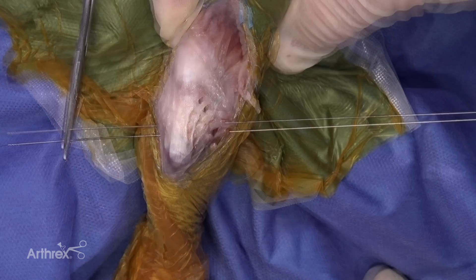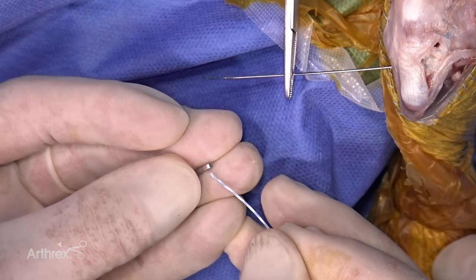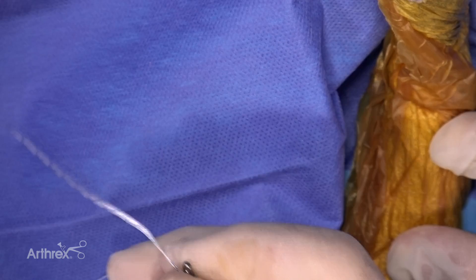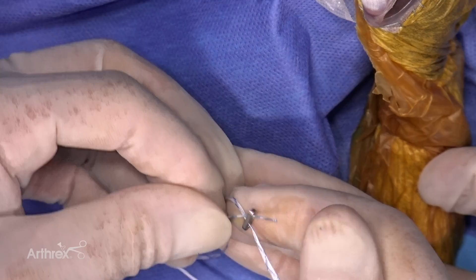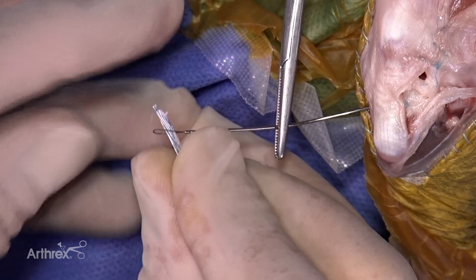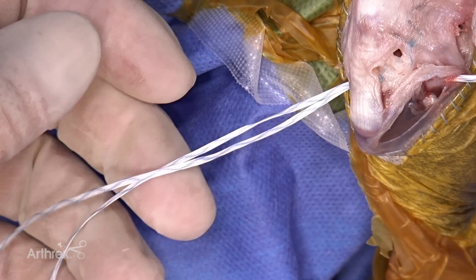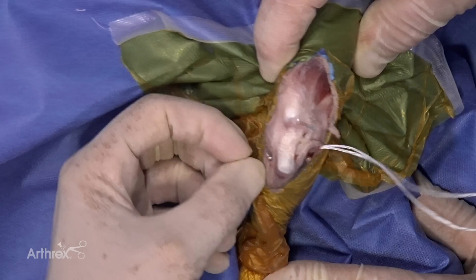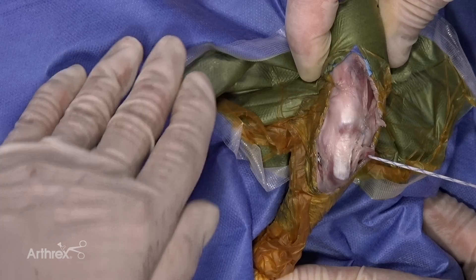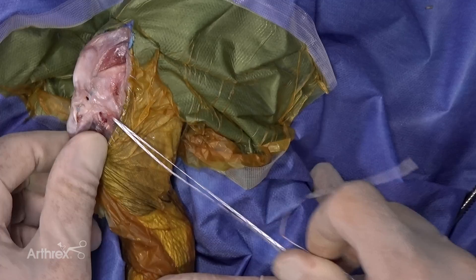This is the 1.3 millimeter suture tape and this is the two-hole button we're going to use. We're going to pass the suture through the button — the one end of the suture is waxed and it's easiest to pass that end through first. Now I'm going to place the suture tape through the loop on the suture passer and pull it through the tibial site. We want it very snug, right up against the surface of the bone. The orientation of the button doesn't matter, it just has to be right on the surface of the bone.